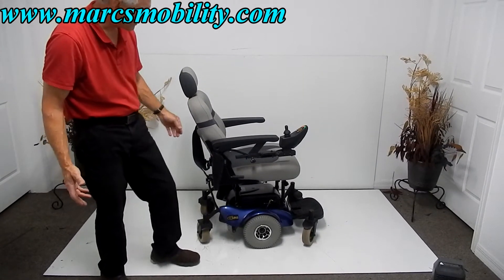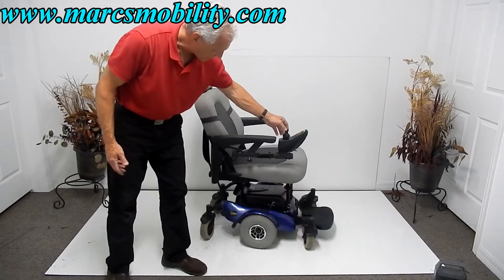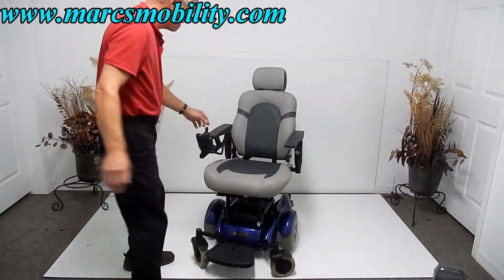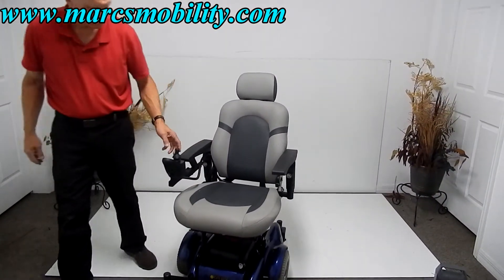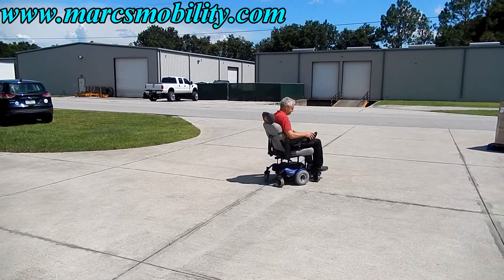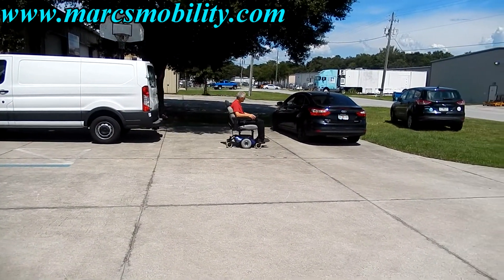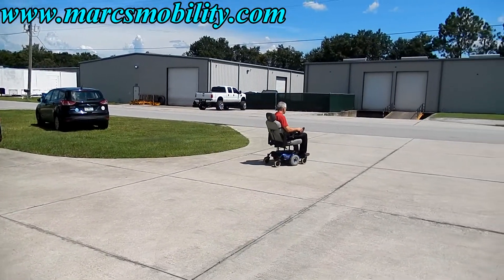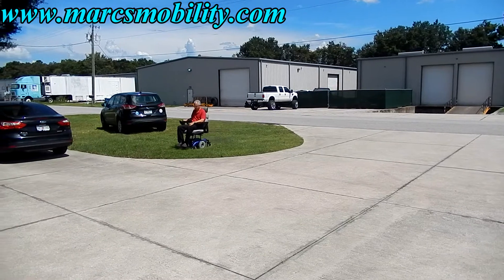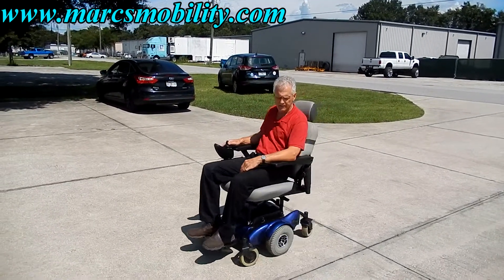This chair is in excellent condition. It's a very simple, easy chair to operate — nothing fancy. It does have a swing-away joystick, which is a benefit, and solid tires. If you're looking for a chair with a fantastic turning radius that's very easy and comfortable to drive, this would be a nice one.